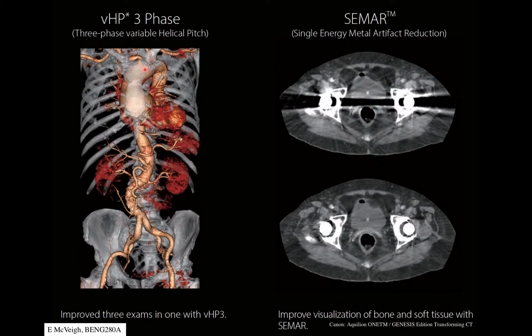The aorta here has a distension, and it's being highlighted by a contrast agent in the blood. This patient was just pushed through the CT scanner at about a meter per second or something like that, and the whole thing's done very rapidly.